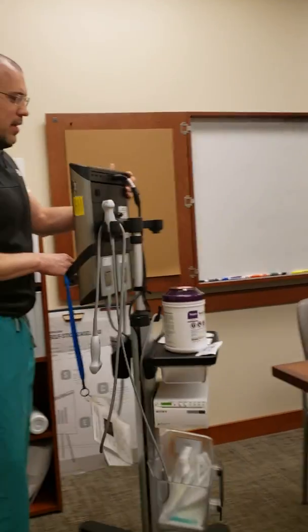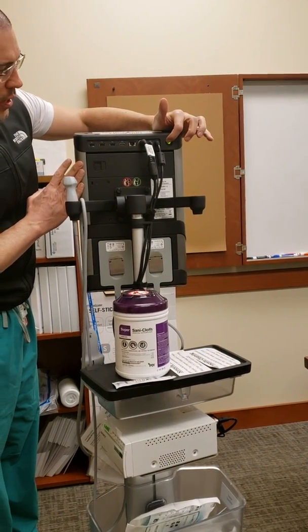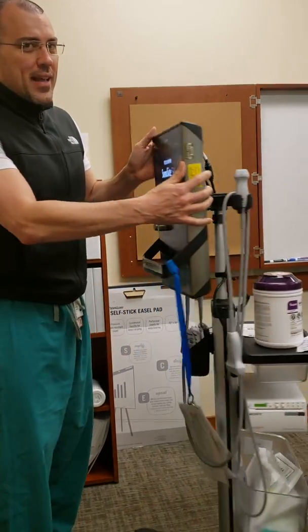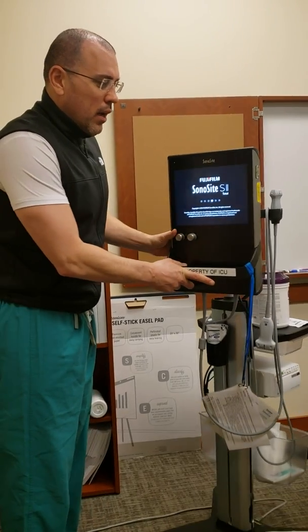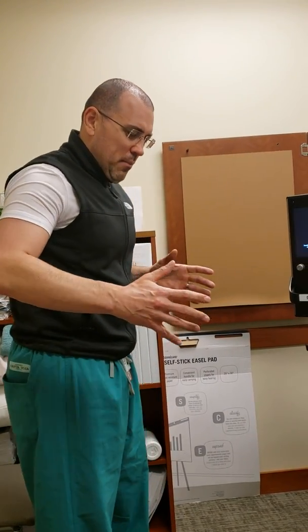Just some basics so we're all familiar with it. The power button is back here. We'll turn it on — even though it has a battery, it commonly goes dead, so we should plug it in. Here it is booting up.